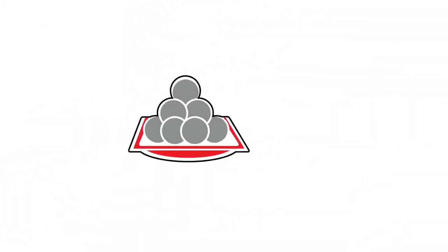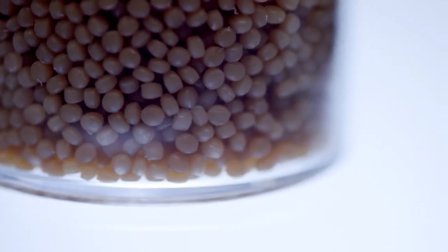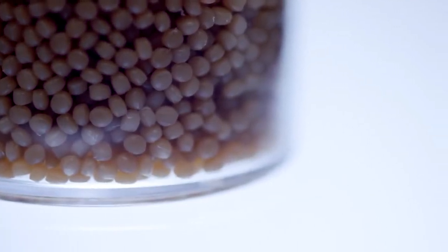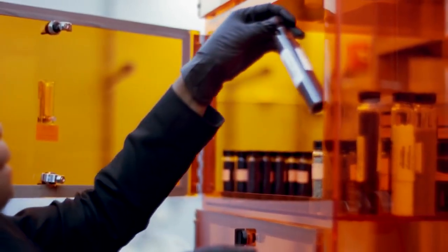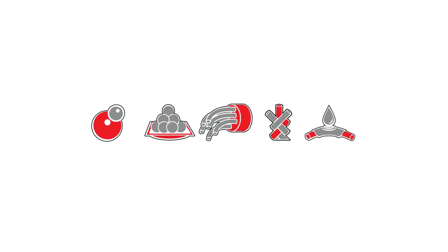After polymerization comes pelletization. The polymer melt is placed into a pelletizer, which hardens and then cuts the polymers into small little pellets for easier transport to the next stage, extrusion.